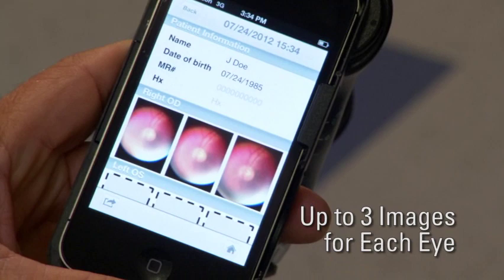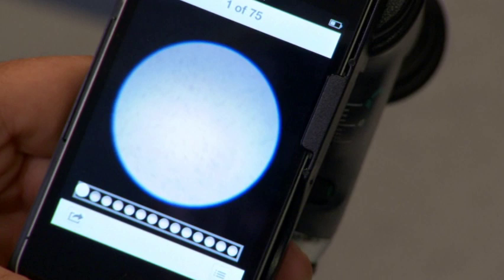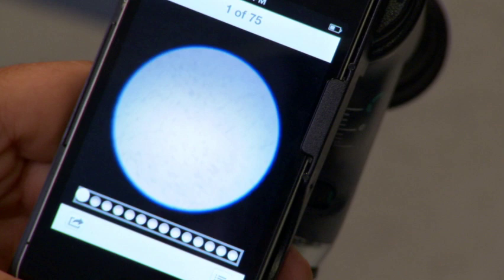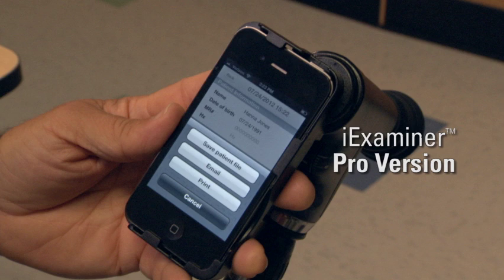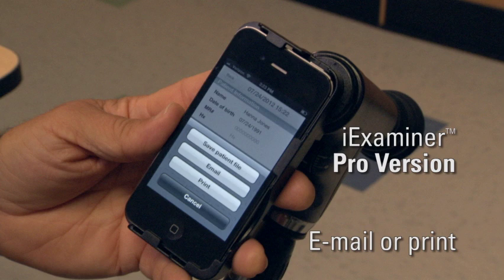To capture a retinal image of the left eye, touch the Add Picture icon in the left OS section of the screen, then follow the same steps as before to capture an image. When the patient file is complete, touch the arrow button on the lower left of the screen, then touch Save Patient File to save. If you have purchased the Eye Examiner Pro version, you can email or print the exam by touching the arrow button in the lower left of the screen and then selecting either Email or Print and following the on-screen prompts.